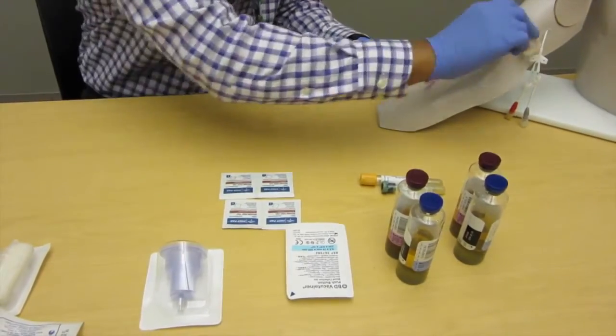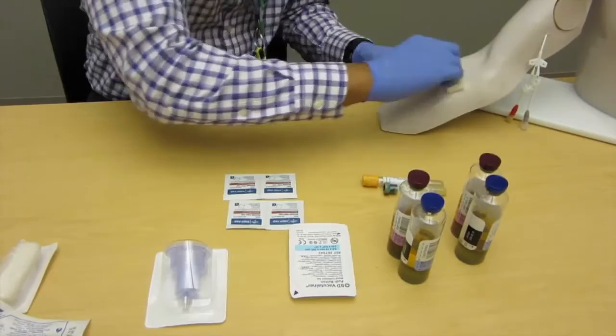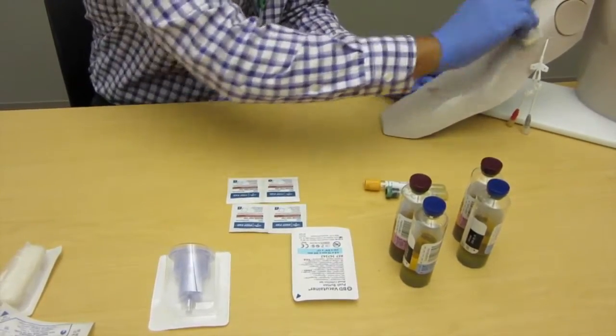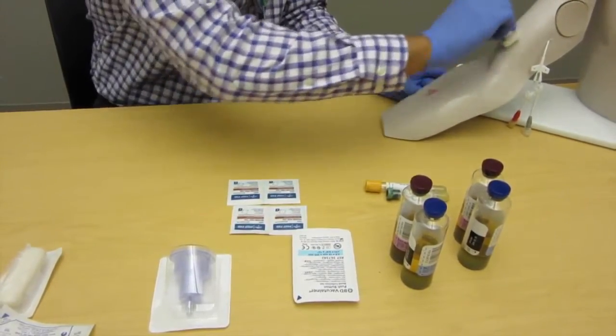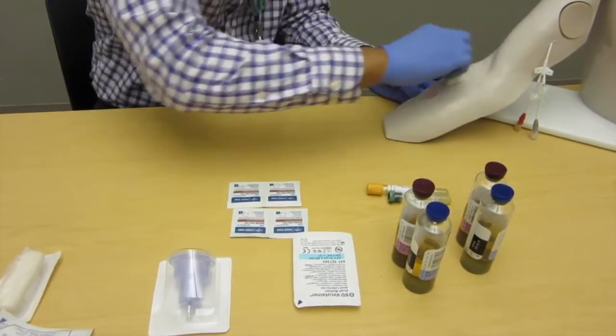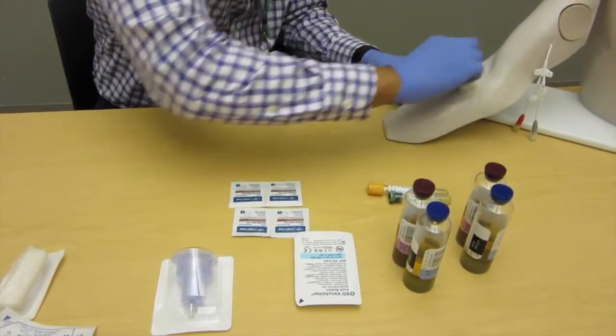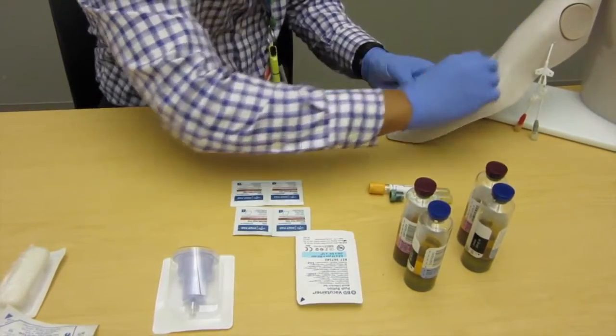Improper technique number one: some people miscalculate 30 seconds. 30 seconds is a pretty long time, and I'm actually going to do this for a full 30 seconds. Start making some small talk with the patient, sing a song. It's a pretty long time, just remember that.